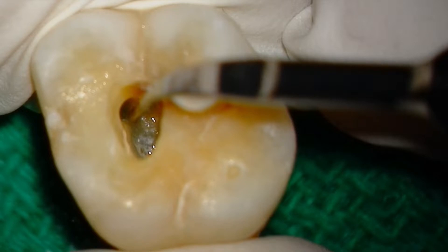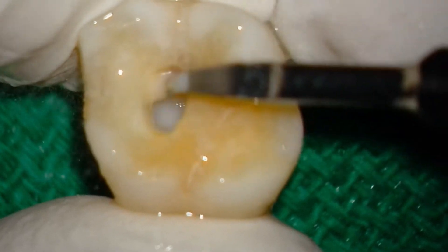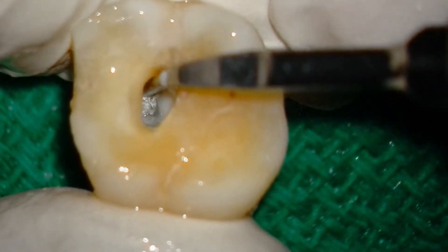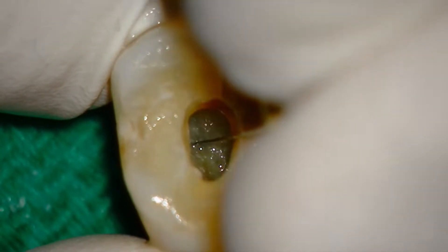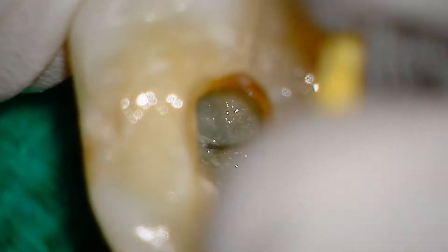Okay, MB2 time. I'm gonna use the Ultramint Pro to drop a line between these two arrows. My intent is to remove this little shelf of dentin. This is the first time I've ever used the Ultramint Pro and it is absolutely amazing. I love this rounded tip — the ability to see what I'm doing at the working end is just incredible, and I can easily adjust the water flow on the handpiece. I can get a file into MB2. I'm going to use the 6-8-10 file progression that my buddy Les taught me years ago to get to working length and establish a reproducible glide path.